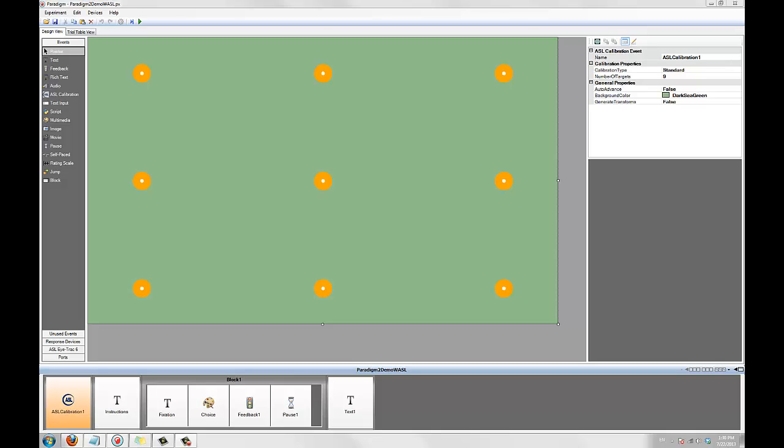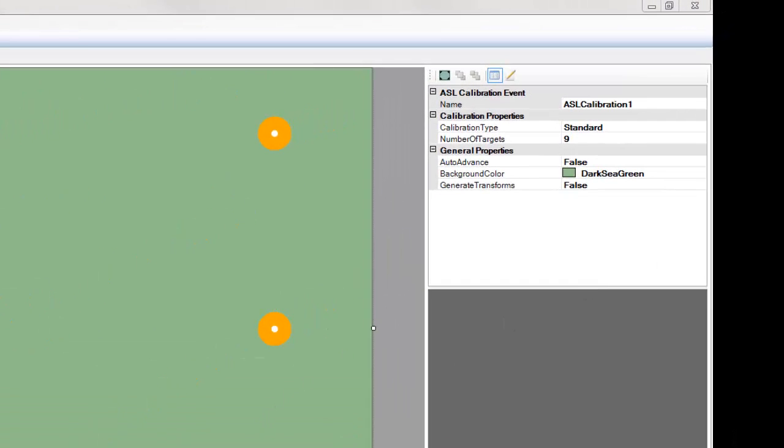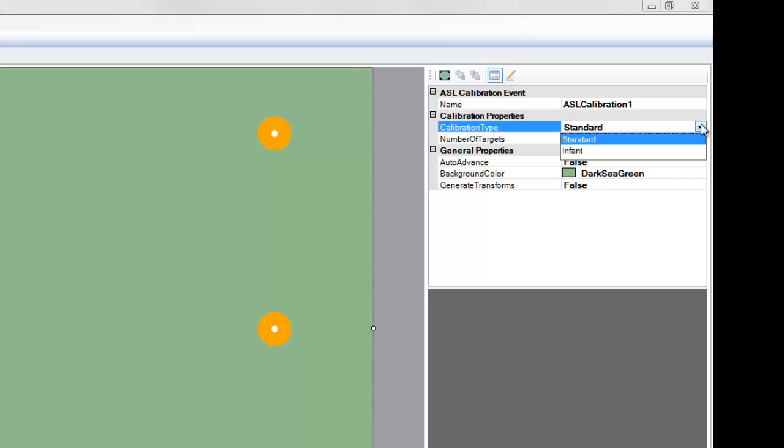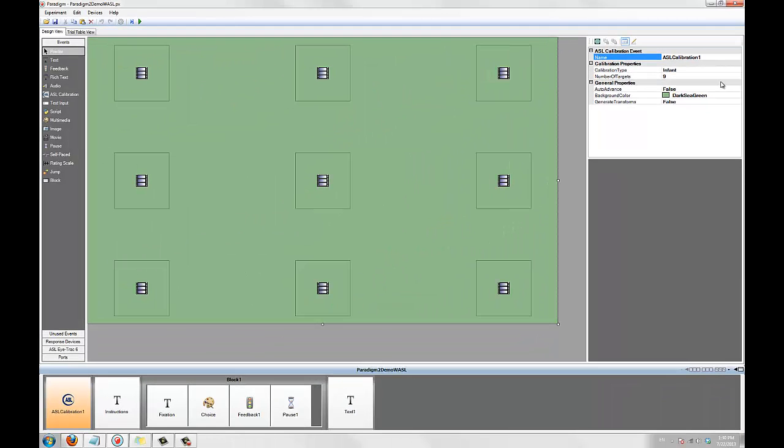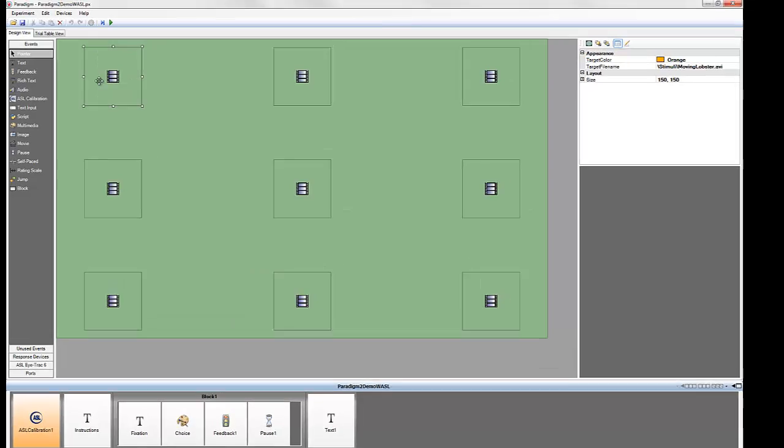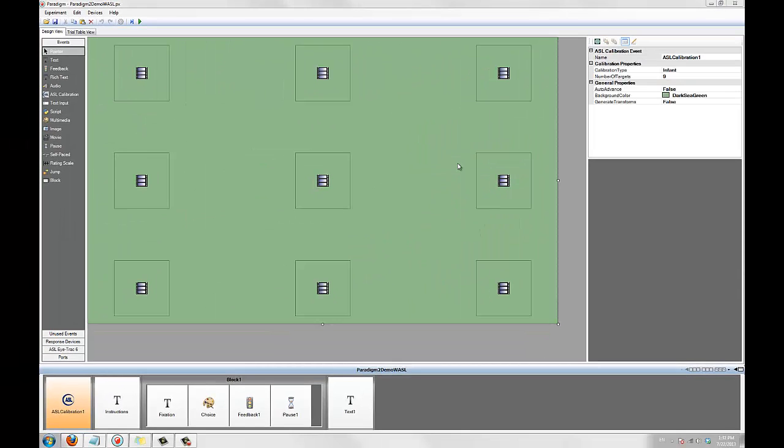Paradigm's calibration event supports two types of calibration, standard and infant. You can specify the type you'd like to use in the calibration events property grid. If you select the infant type, you'll see the calibration points change on the designer surface. You can specify a movie or image for each point by clicking on it and changing the target file name property to either an image or movie file name. To specify the number of targets, change the number of targets property.